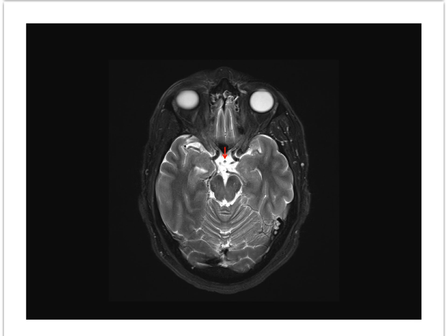Moving higher, we see the infundibulum coursing through the suprasellar cistern between the hypothalamus above and the pituitary gland in the sella below. The interpeduncular cistern, which we can also see on sagittal and coronal images, is a good landmark for the oculomotor or third nerve exit site.